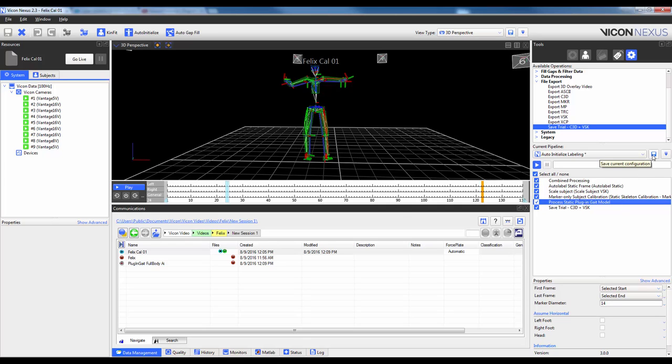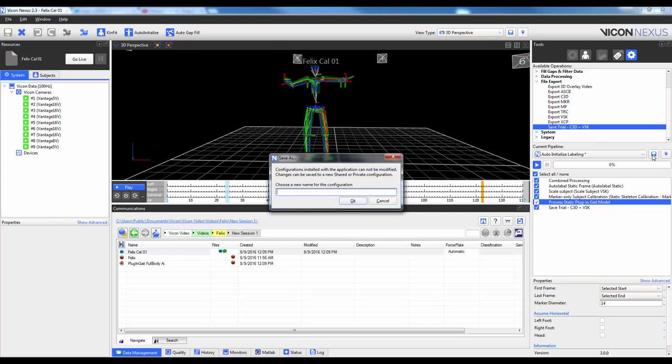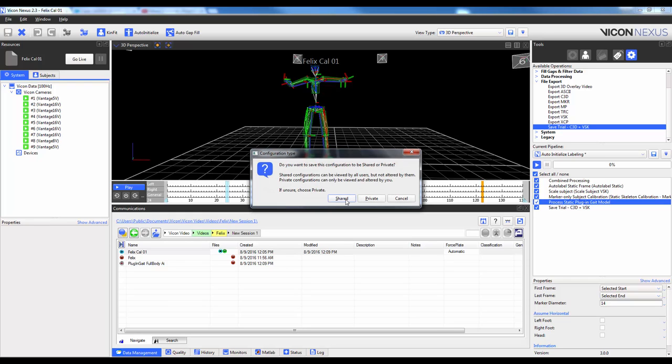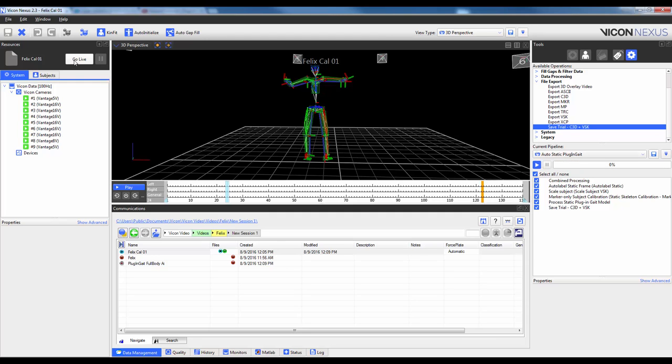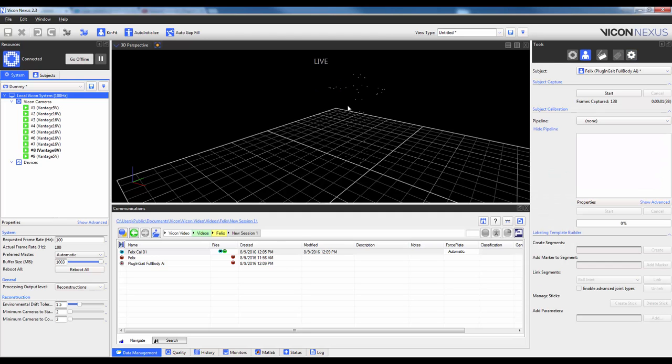So I'm going to save this as a new pipeline. I'm going to press that save button. It's going to ask me to put in a new name as I cannot save over any pipeline that's got this nexus icon next to it. So I'm just going to call this auto-static plug-in gait. And then hit OK. And I'm going to go ahead and make this shared so that everyone has access to it. So you can see now I actually, in my pipeline list, I have a new pipeline that's called auto-static plug-in gait.